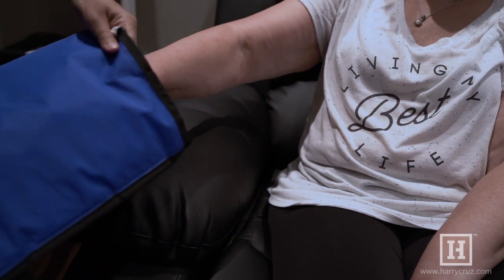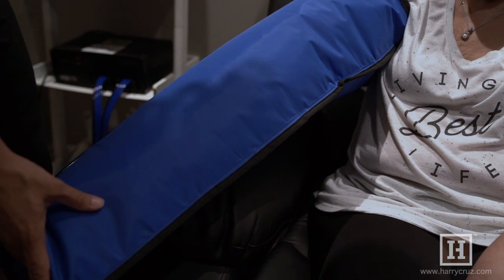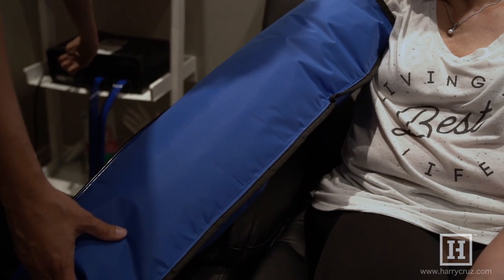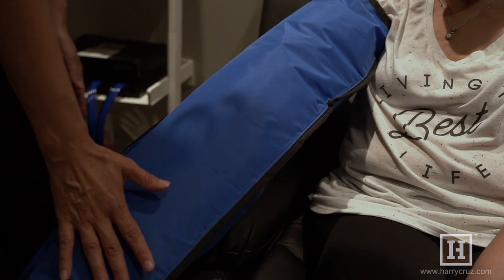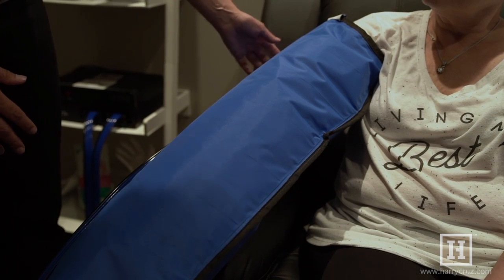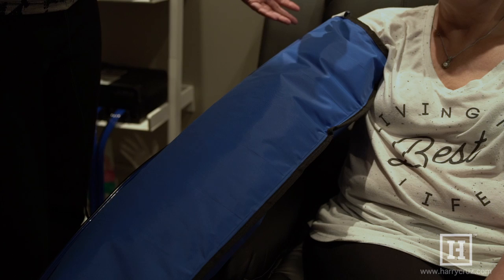We're going to put the arm sleeve on and bring it right up to the axilla, all the way down the arm. We have eight chambers here, and we're going to turn it on. It's going to be 30 millimeters of mercury pressure at the hand, reducing to 20 millimeters of mercury at the top of the arm. It's going to sequentially move the fluid up the back.